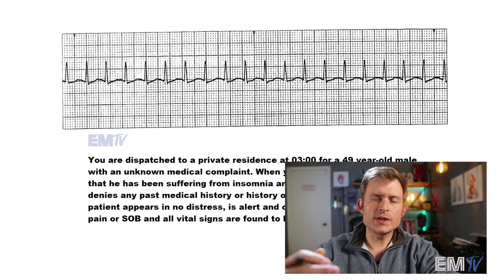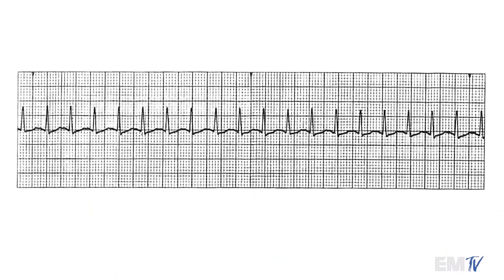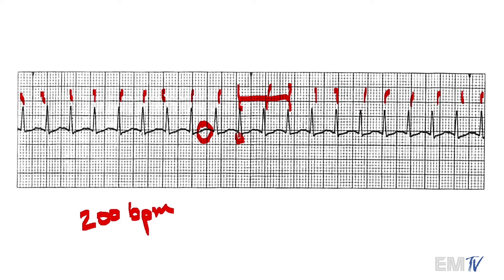Let's go ahead and dive right into this one. You can see right away that this is a relatively fast rhythm. When I'm identifying this rhythm, I'll first look at the QRS complex. It's very narrow and the R-to-R interval is nice and regular. I'm also not seeing any real good P wave or T wave separation — they're kind of jammed together into one amalgamous wave. I'm counting 20 beats there on a six-second strip, so 20 times 10 is going to be 200 BPM. Based on the fact that it is nice and regular, the QRS complex is narrow, and there's no real semblance of a separate P or T wave, I'm going to diagnose this as SVT.